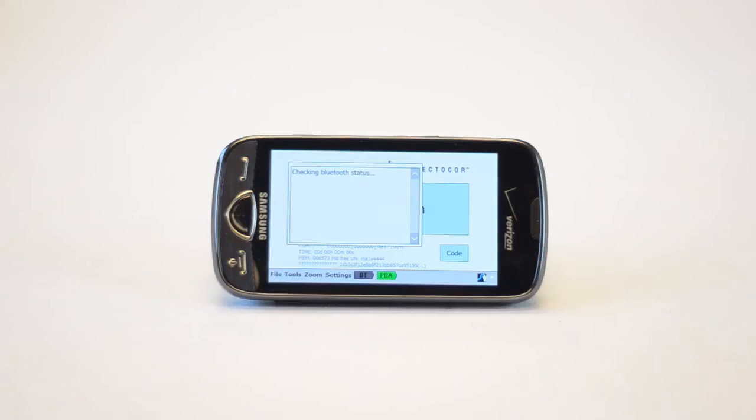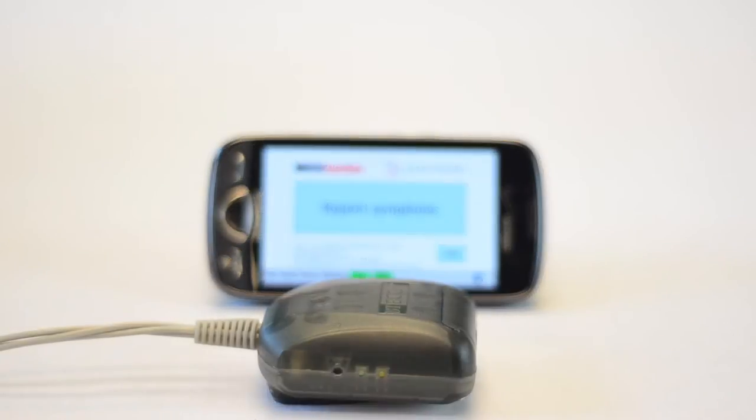Wait for the PDA to connect to the heart monitor. The green blinking light on the heart monitor indicates the devices are communicating.